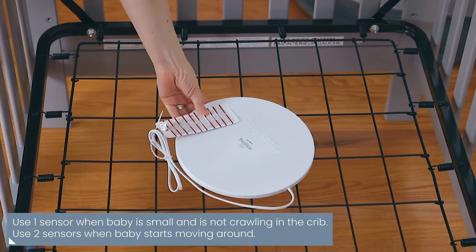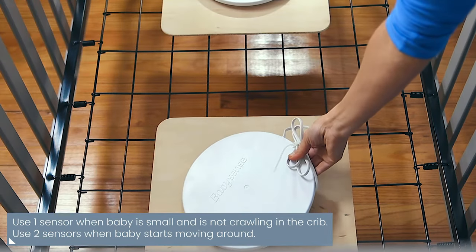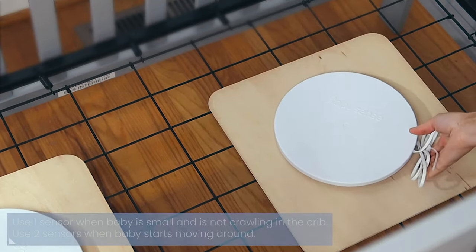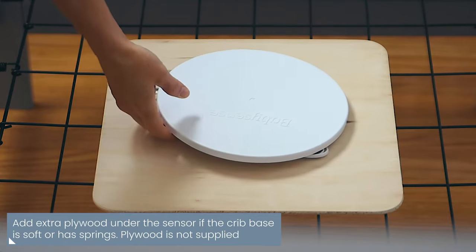For babies who are not yet crawling, use only one sensor. When your baby starts moving around, use two sensors to ensure full bed coverage. When using a crib with a soft or spring base, add plywood under each sensor to ensure proper contact with the mattress.